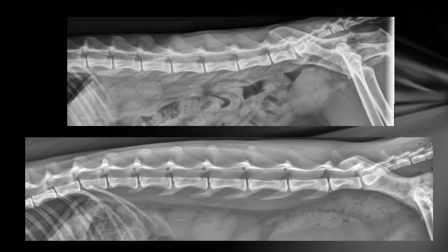These are radiographs of the lumbar spine, in this case, a cat. And you see this is too oblique. The wings or the pelvic portions are not superimposed with each other between the left and right. The transverse processes are not superimposed with each other. Now, if you're looking for an obvious bone tumor or something, this might suffice.